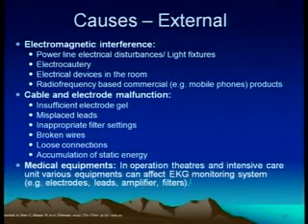Electrical devices in the room, then radio frequency based commercial products like mobile phones, as I was just mentioning, will produce artifacts in the ECG, maybe in the actual graphics or also on the recordings done on a monitor. Then cable and electrode malfunction. This is again very important.